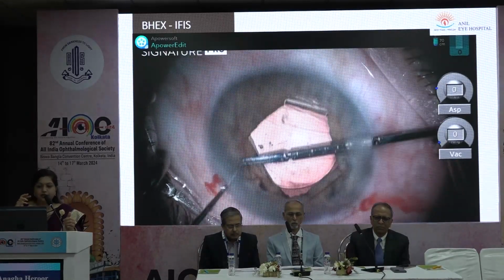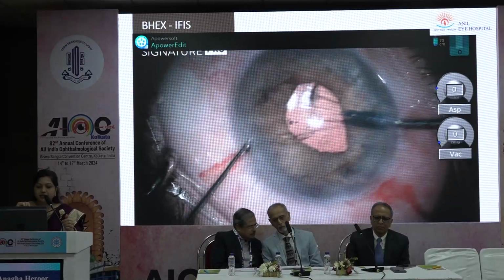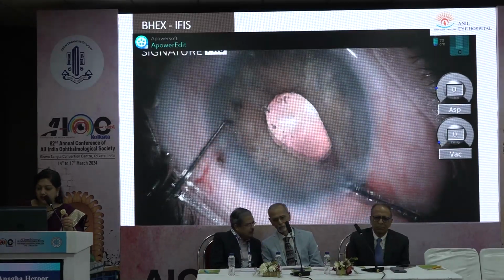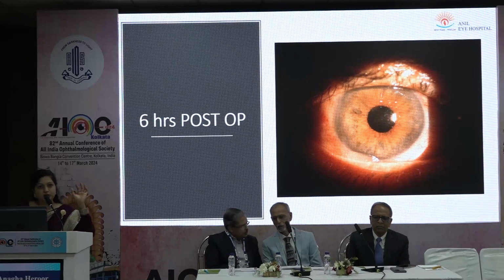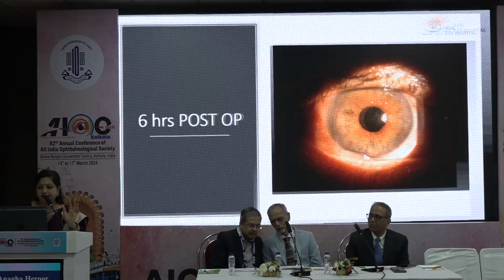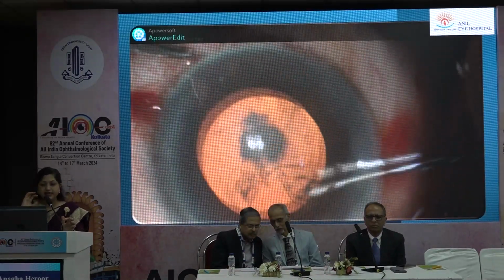So all you need is to disentangle the flanges and then just hold on to the flange which is closest, and it can come out easily. So this was the patient 6 hours post-op. You can see how the pupil is nice and round. So we have used it in cases with multifocal IOLs also because it's very gentle.